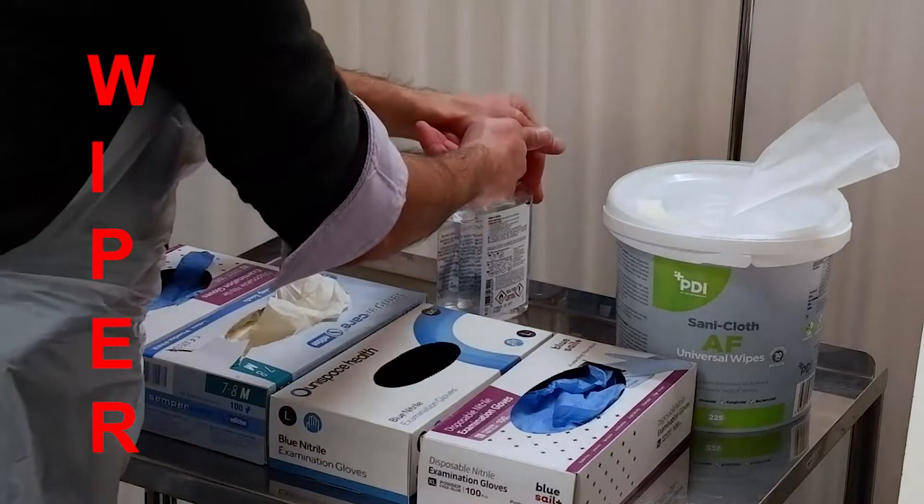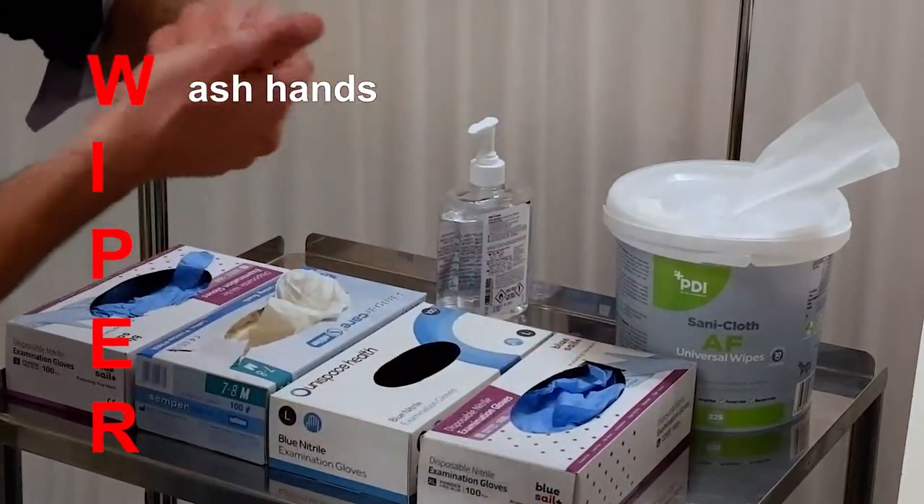To begin the procedure, wash your hands, wear an apron and gloves.